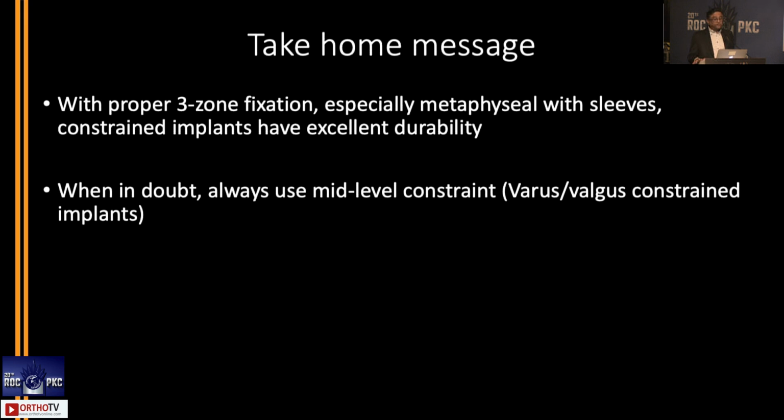With proper 3-zone fixation, especially metaphyseal with sleeves, constraint implants have excellent durability. When in doubt, always use mid-level constraint, that is, varus valgus constraint implants.